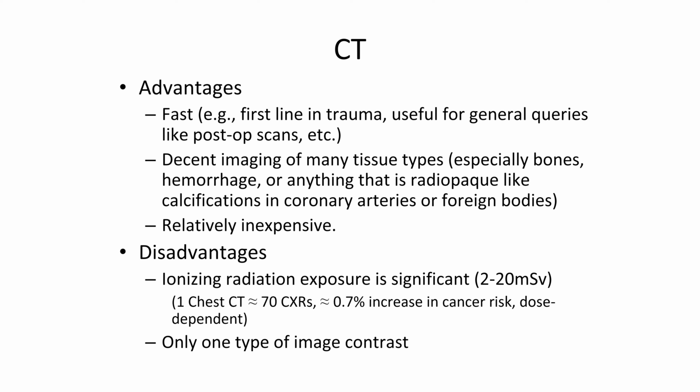But you also have to put it in context of what our average daily exposure is to the ambient environment. And so on average, that's thought to be around 3 millisieverts per year. So in the scheme of things, typically this is said to produce about 1 death unnecessarily per 2,000 CT scans, or about a 0.2% incidence of cancer. 0.2% of cancers can be explained by exposure to CT scan, and that may be higher now that CT scans are much more common. Some studies have suggested that, but just something to think about.